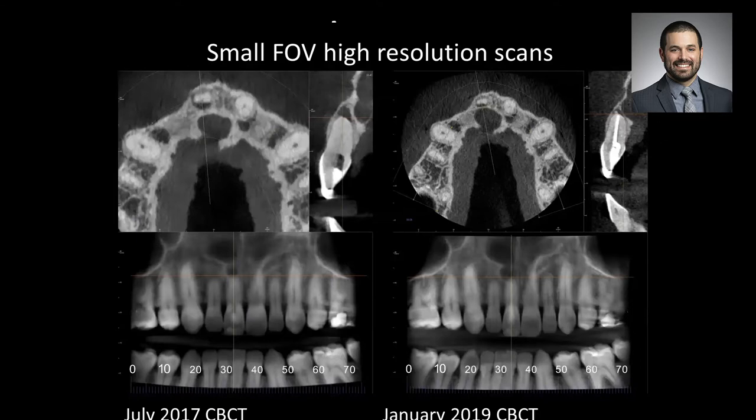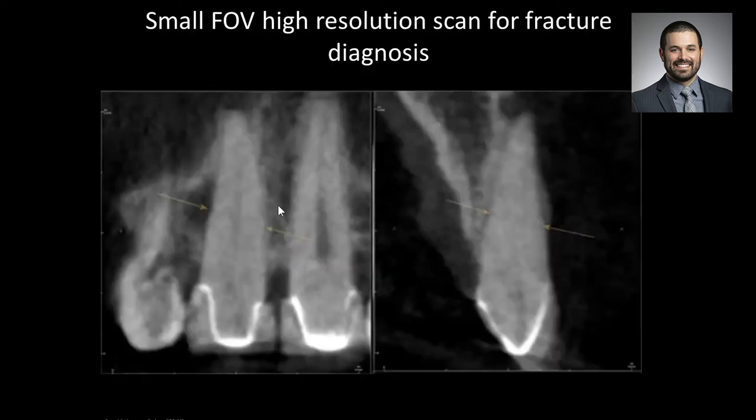what in the world is going on posterior to it with this large radiolucent mass. And if you were able to attend one of our cone beam CT hands-on courses, we talk a bit about volume superimposition and that approach and pathology like this. Again, reinforcing this use of the highest resolution possible.